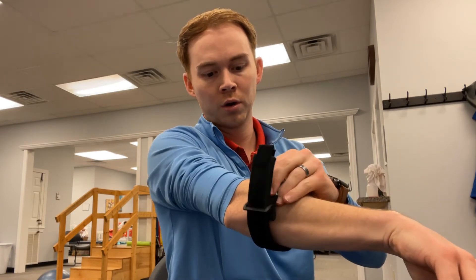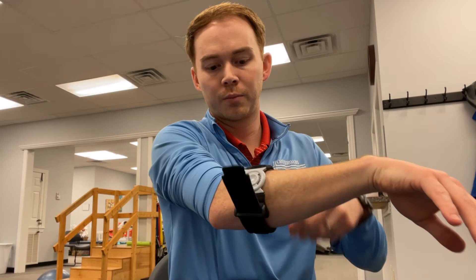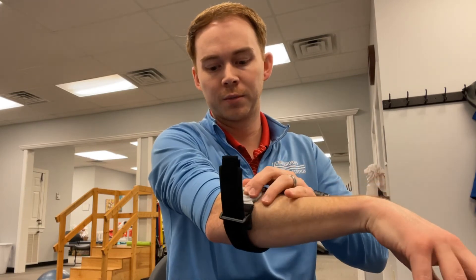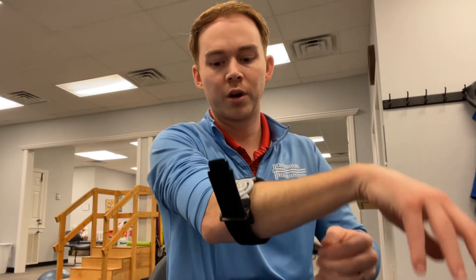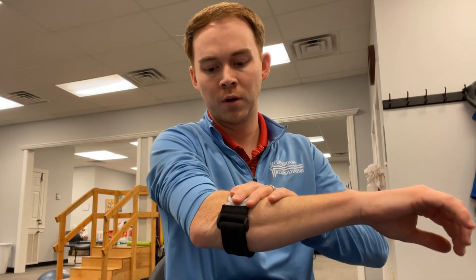Just to show you what this looks like on — you'll put it right over the desired or targeted area, usually over that extensor muscle belly or somewhere near that area. Pretty easy to tighten up and strap on. Make sure it's in the right place.